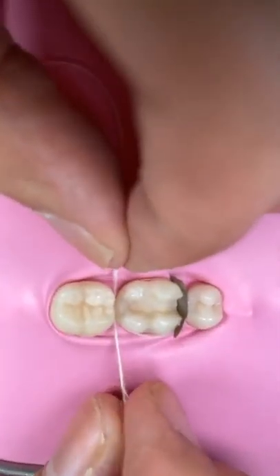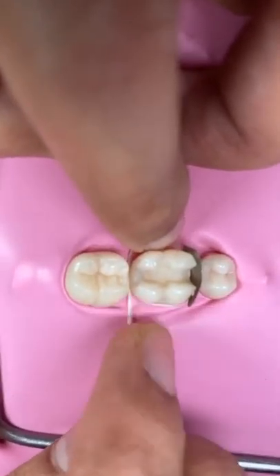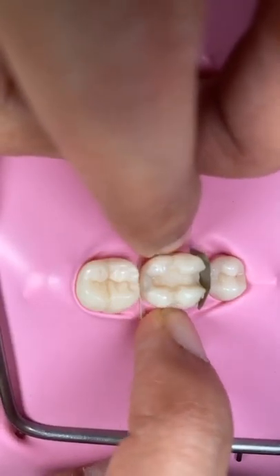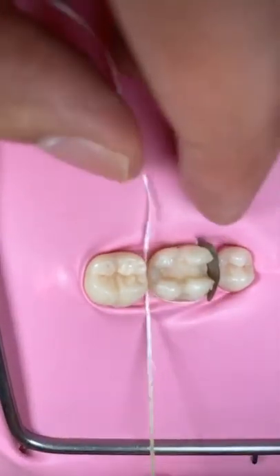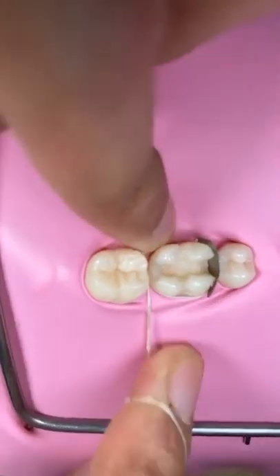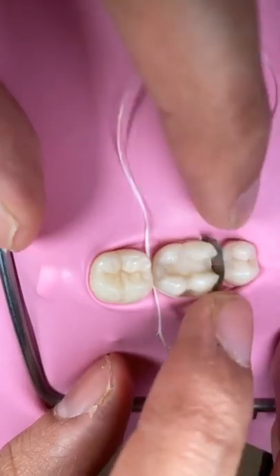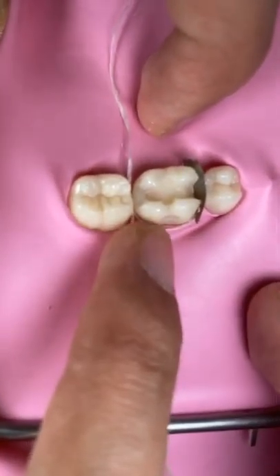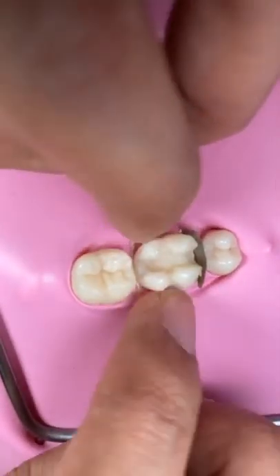Okay, so everyone keeps asking me, doctor, what kind of ring do you use? What is the best ring in the world? You know, there's no best ring, no best matrix, because the matrix itself cannot guarantee you a very good contact. What can guarantee the contact is your matrix placement and your marginal seal. Okay, make sure there is no leakage there, and don't forget about the buccal here, since there's a flush there that covers the cavity.